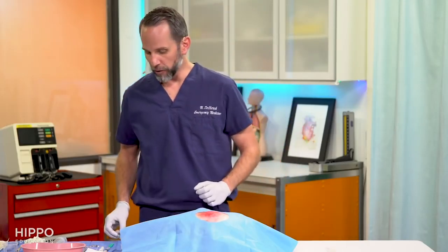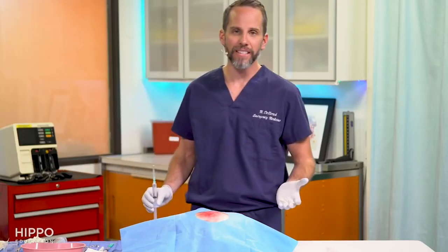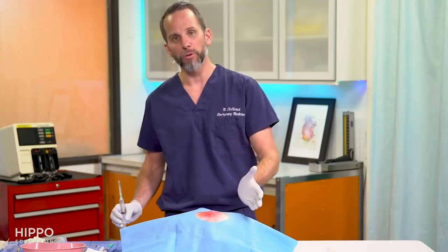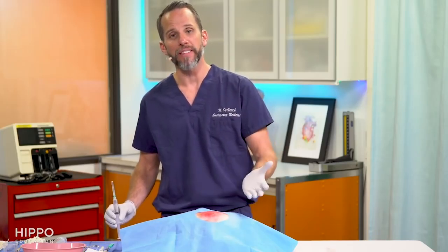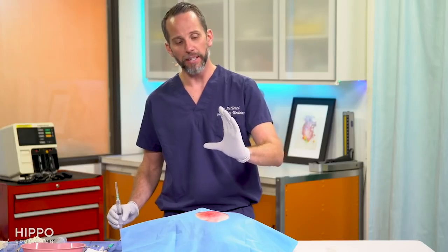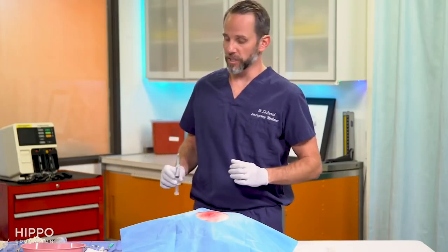Another helpful tip: if you're unsure there's an abscess or you're trying to locate the pus pocket, ultrasound is very useful. Take your linear probe over the area of erythema where you think the abscess is, and you'll be able to see the abscess pocket as a darker area if pus is present. We can review that in one of our ultrasound videos.